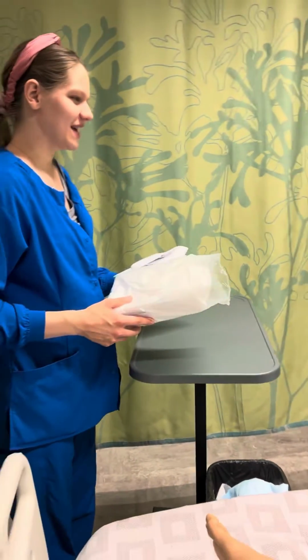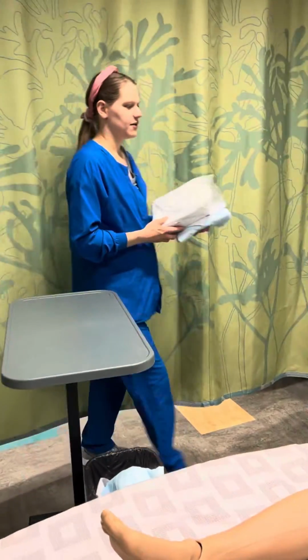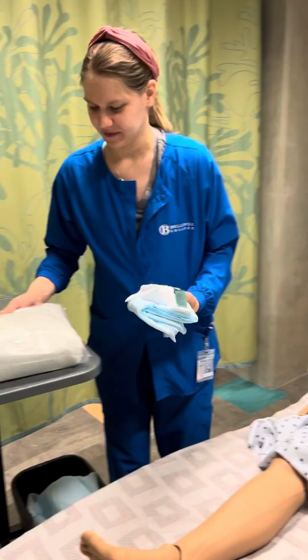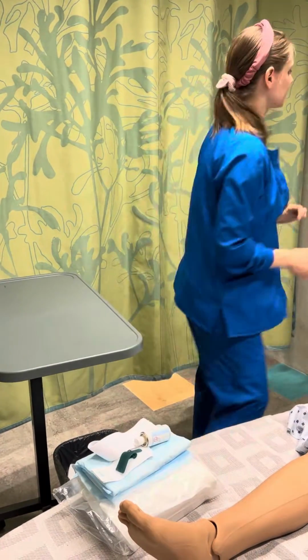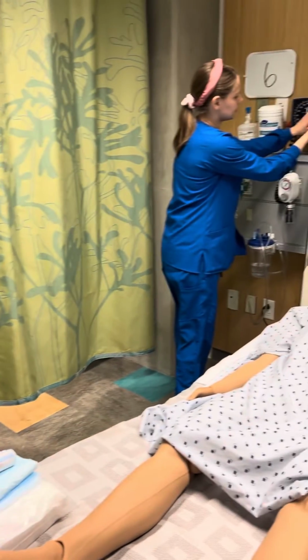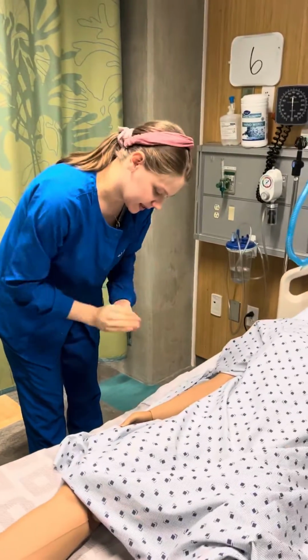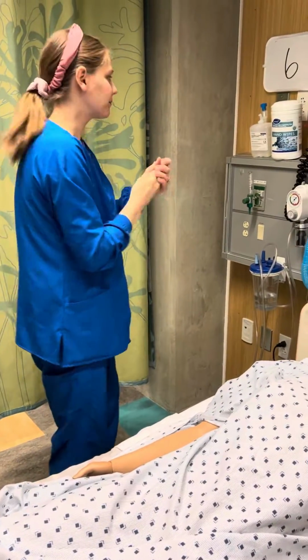Hi Mrs. Smith, I'm here to insert your Foley catheter. And how are you feeling? Do you have any pain? No? Excellent. Alrighty. I'm just going to set my supplies down. Perform hand hygiene. And can you tell me your name and date of birth? Yeah. And I check and it matches her armband and the chart as well.